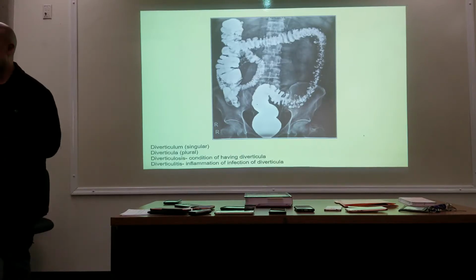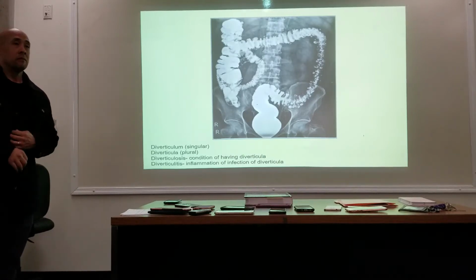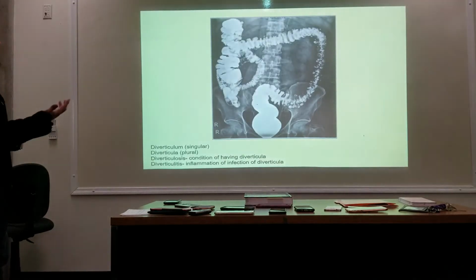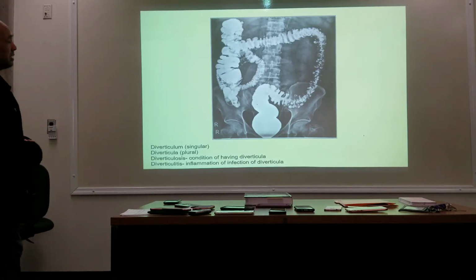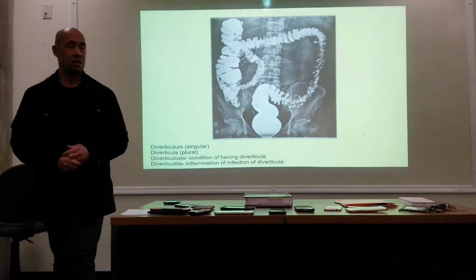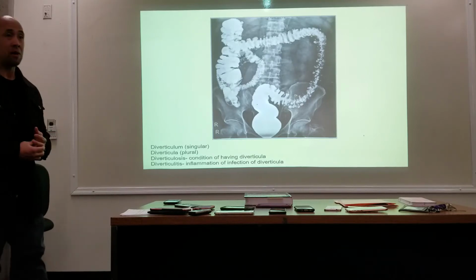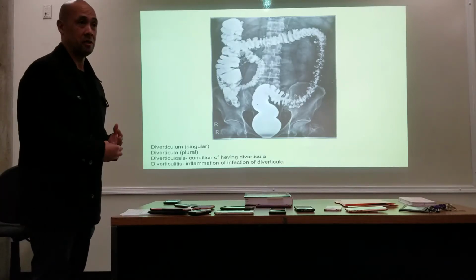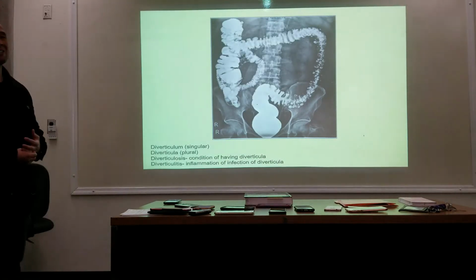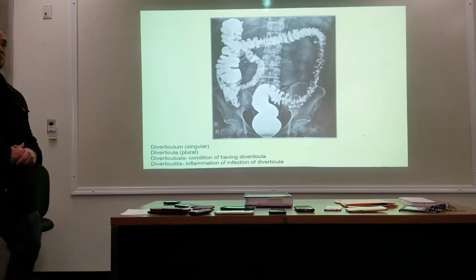Okay. Everybody got this? Is that both diverticula and polyps? What is being shown? I don't know. I mean, I see a lot of the diverticula. It's hard to see the polyps because it's inside. And if you got contrast in there, you may block it. But there are ways to study polyps, and we'll talk about that in the positioning. It's harder to see the in-pouching, especially if it's filled with barium. So to answer your question, I can't tell. It's not in the correct position to identify polyps.